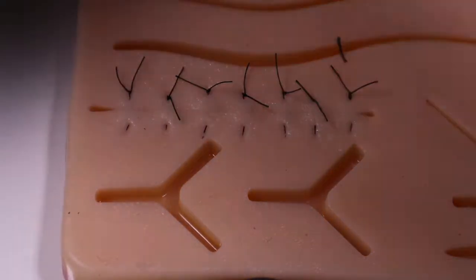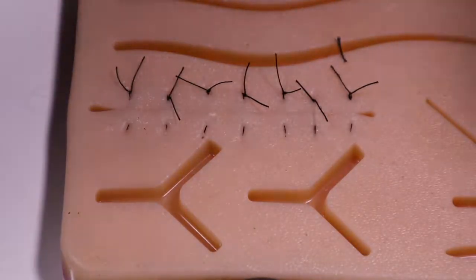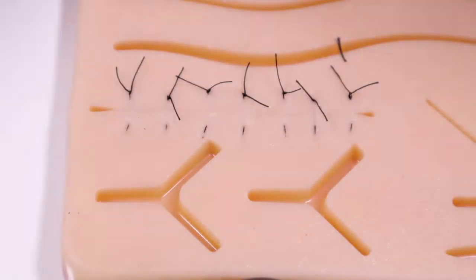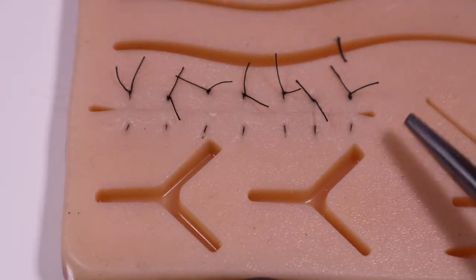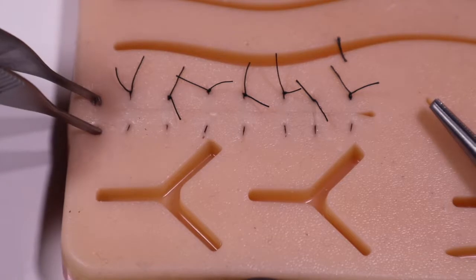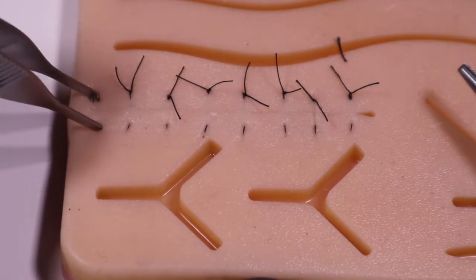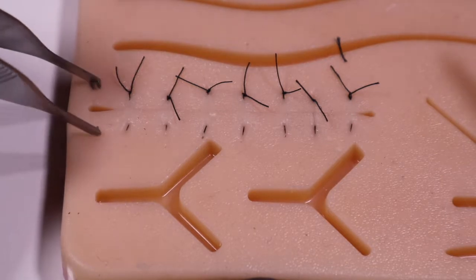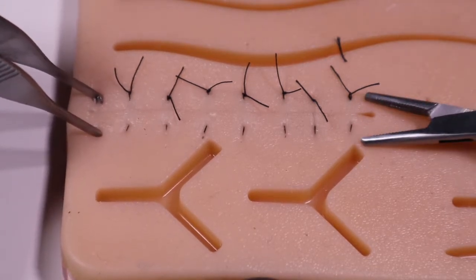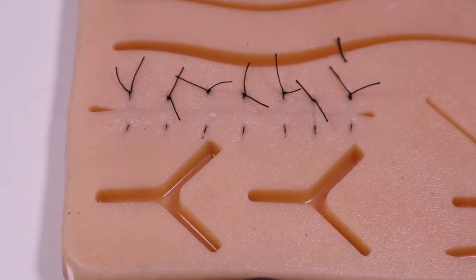Now because of the design of this particular laceration on the suture board, it has rounded edges so those edges are not closed. If we wanted to close that on the suture board we could put another suture just right on the end, but most lacerations will not have those rounded edges so that would be closed.